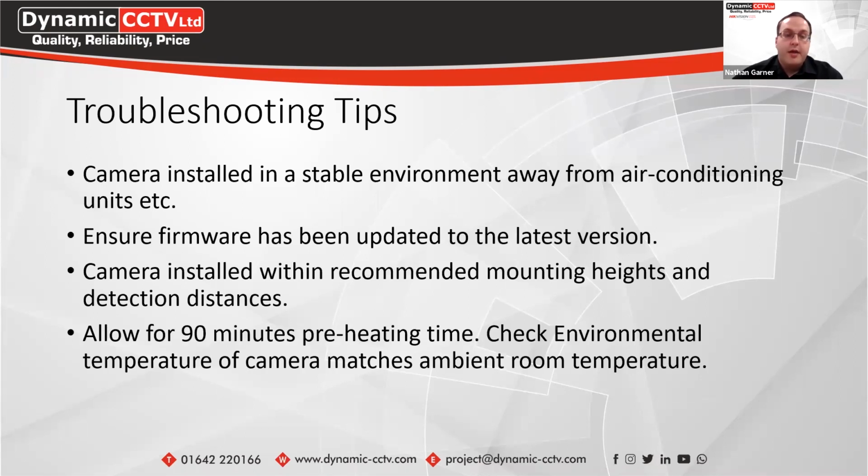You also need to ensure that the 90 minutes preheat time has been followed. So if a camera's been turned off on a night when everyone's left the building and then it's turned on in the morning, you would need to allow the 90-minute preheat time before you can start getting accurate temperature readings.